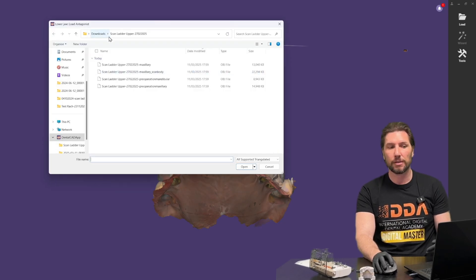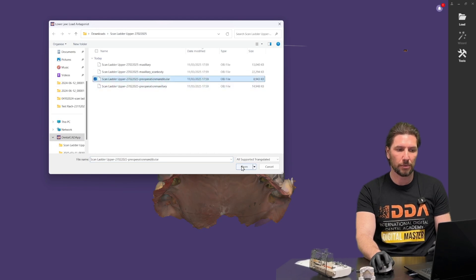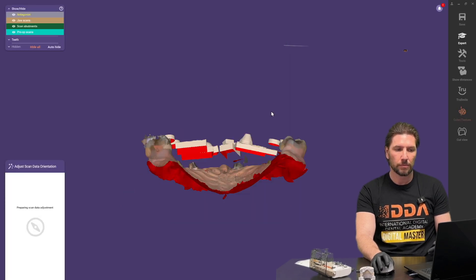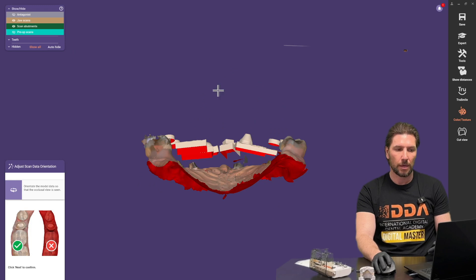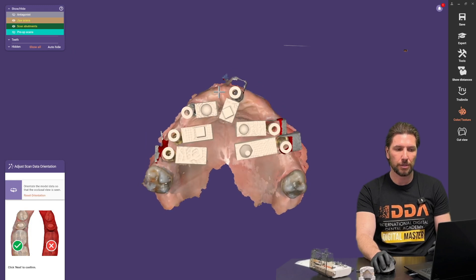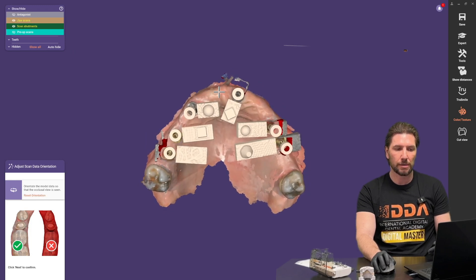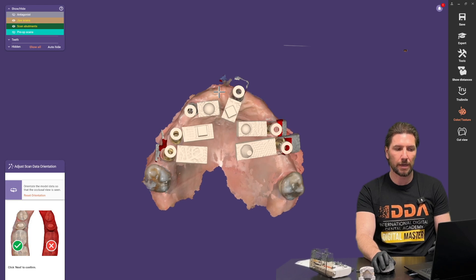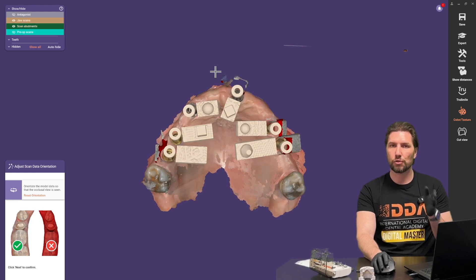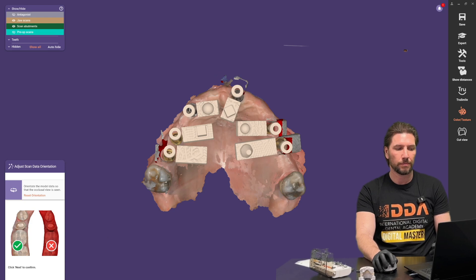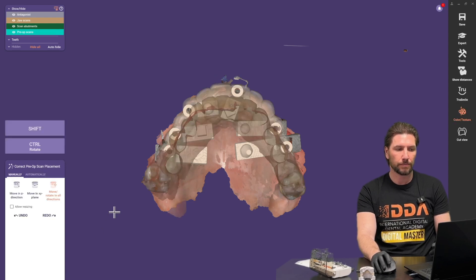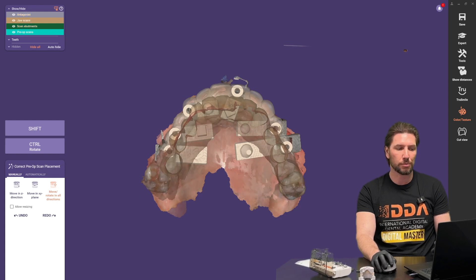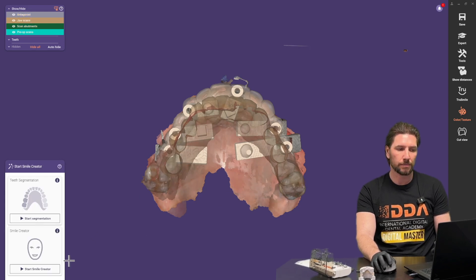And then it's asking us to bring in the antagonist so let's click on that pre-op mandible and then we're going to set the orientation here to be able to orientate ourselves later on. So we're going to set that with the view straight down as a bird's eye view. I'm going to click next. Do we need to correct the pre-op placement? We don't in this case so we're going to click next.